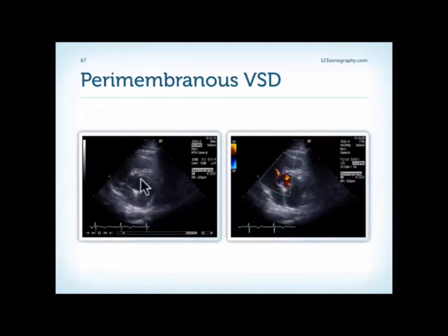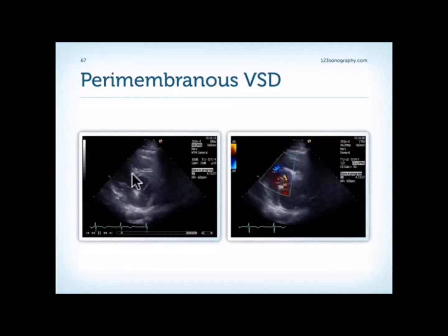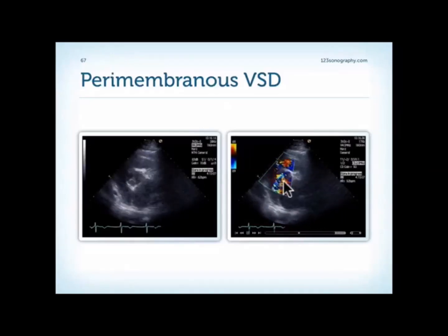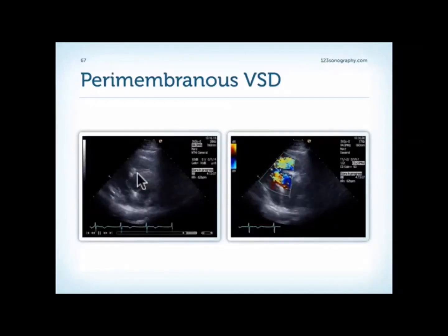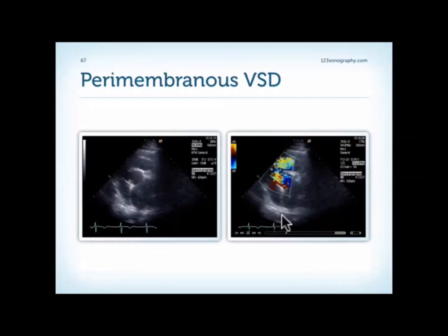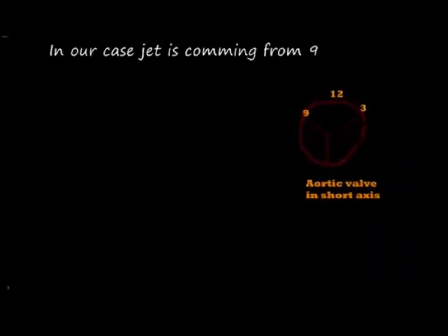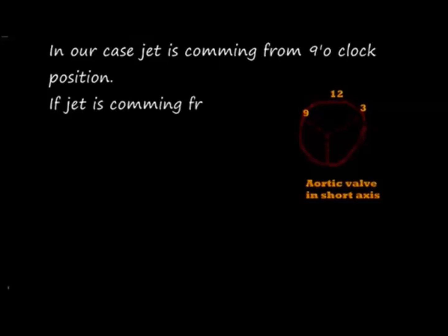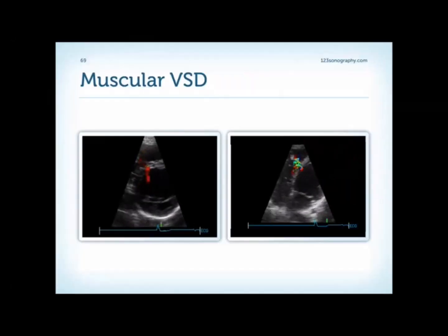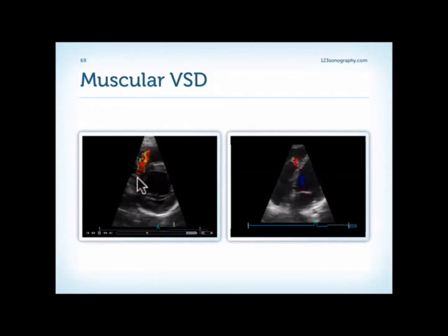Remember the left ventricular outflow tract close to the aortic valve. In the 2D image there is some aneurysmatic transformation, and looking at the color Doppler we can see that there is still a significant shunt. When we only look at the 2D image this could also appear to be a spontaneously closed defect. Here again, a trabecular or muscular VSD is seen in the short axis view of the septal defect.